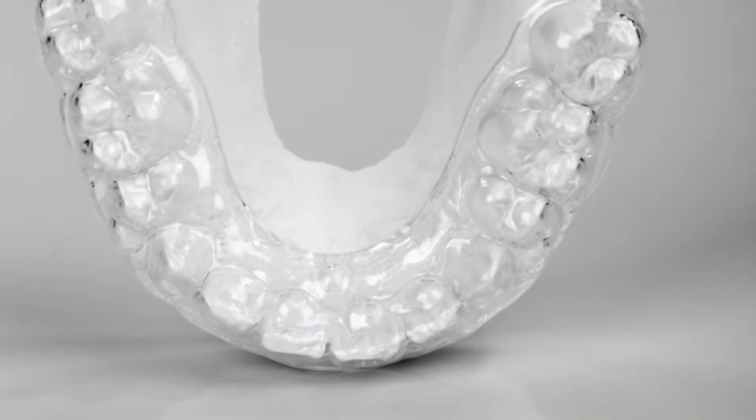One, once we take the braces off, we often see that patients may not be as compliant about wearing their retainers as we would like. So if teeth do shift or move a little bit, the Essix Retainer, if worn more often, can actually move teeth back to that perfect alignment that you had the day the braces came off.